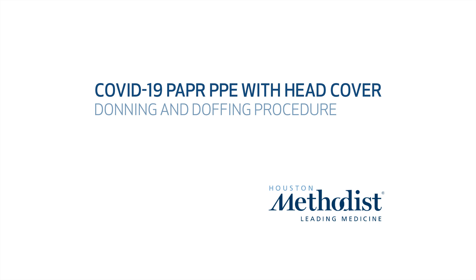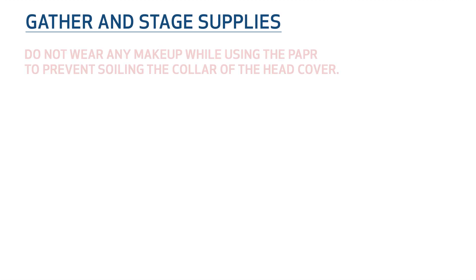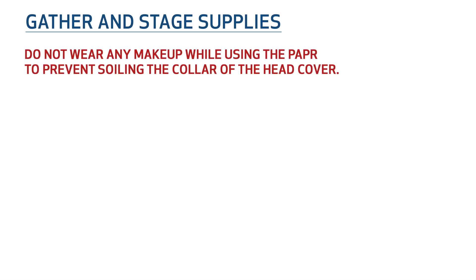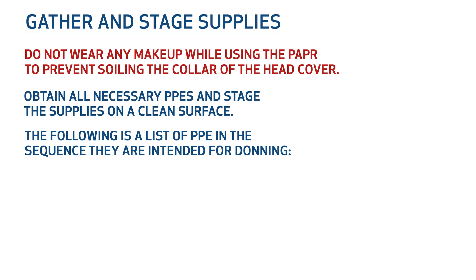COVID-19 PAPR PPE Donning and Doffing Procedure. Gather and stage supplies. Do not wear any makeup while using the PAPR to prevent soiling the collar of the head cover. Obtain all necessary PPEs and stage the supplies on a clean surface. The following is a list of the PPE in the sequence they are intended for donning.